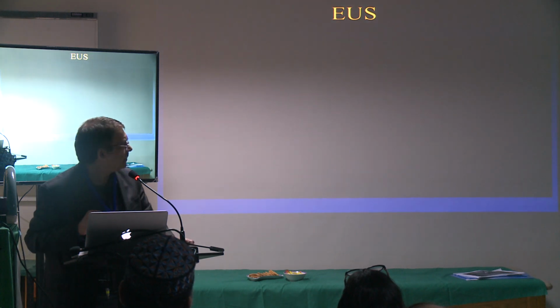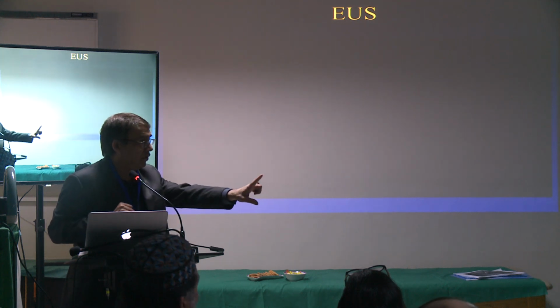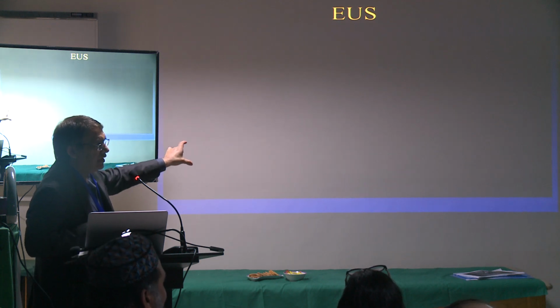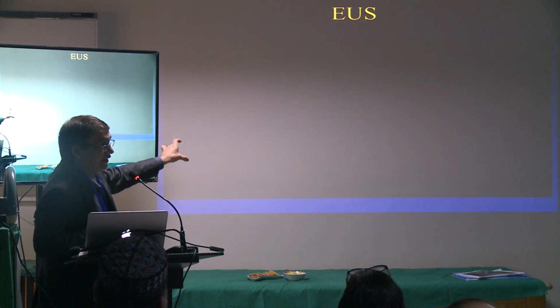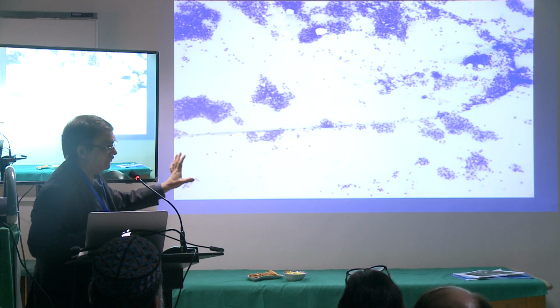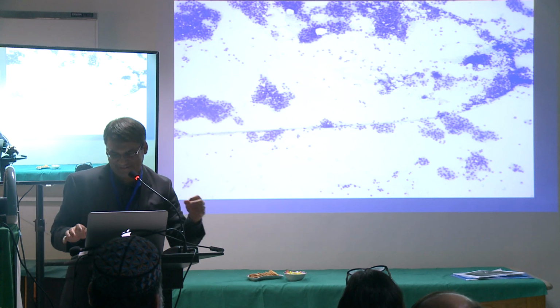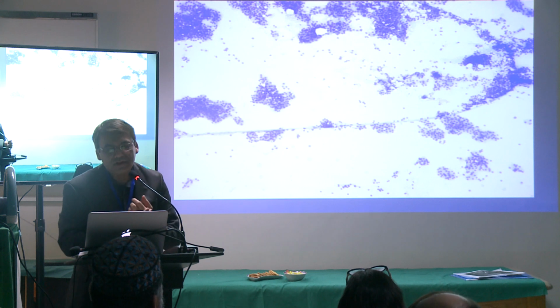I think it may be better projecting on the other screen. Anyway, this is not mine. This case is not mine. This is somebody else's, which I would never follow that FNA technique. Sorry. I would literally never do it that way. Anyway, not my case.